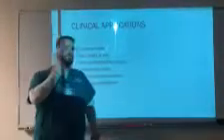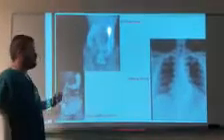The esophagram is to see how the patient swallows and to see if there are any obstructions going down the esophagus. The IVP, intravenous pyelogram, is for the urinary system and the kidneys, and they also use it for cardiac catheterizations.